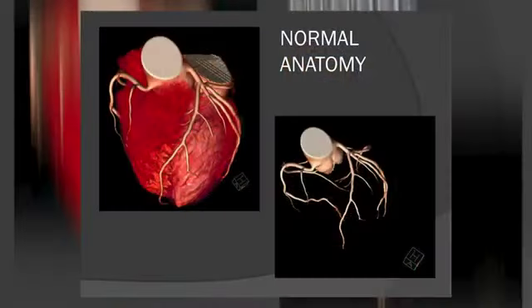So let's walk you through some images. A lot of slides talking about drab literature, so I'll try and color it up a little. Here are some images, and these are post-reconstruction images, so you should be able to appreciate this is not the real heart, okay? This is a computer-generated image of the heart acquired by the CT scan. So this is the root of the aorta. You can see the coronary arteries coming out, and these are the ventricles, the chambers of the heart. And you can see there's no motion, no blur, no artifacts. The details are just fabulous, right?